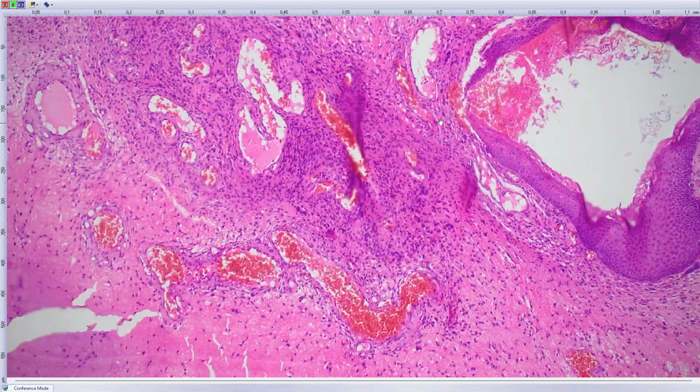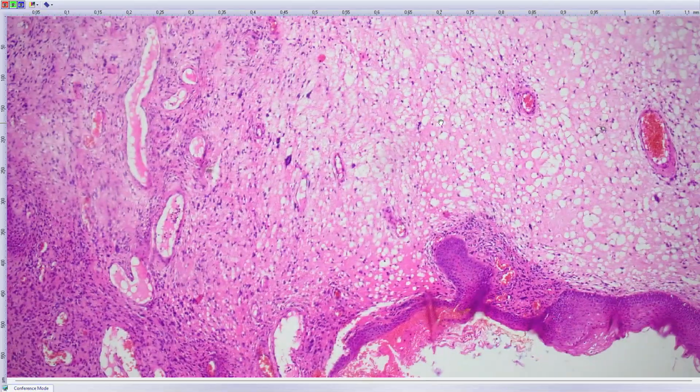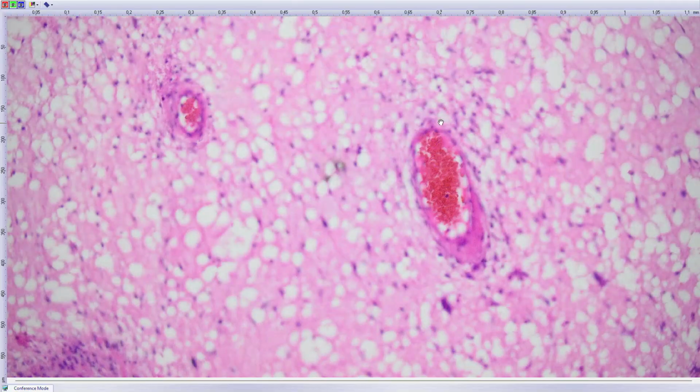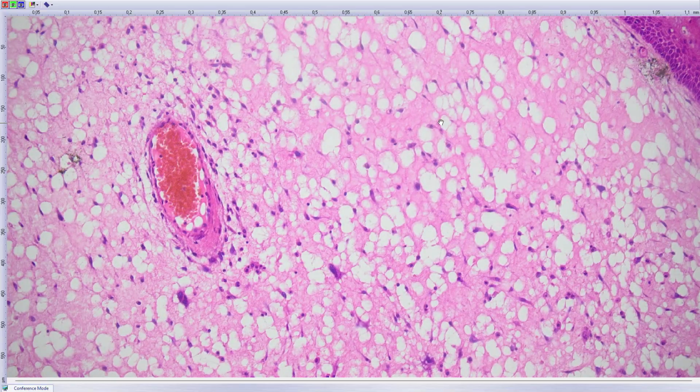You see, it's very similar. Yeah? In this case, a small part of that looks benign, but I still think it's the same thing as the previous two cases I showed you. It was published in the 60s, it was recognized as a pitfall.